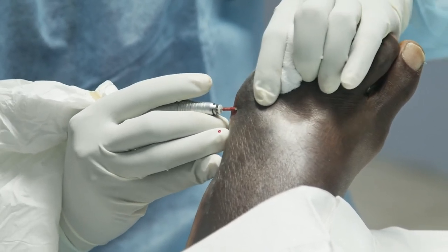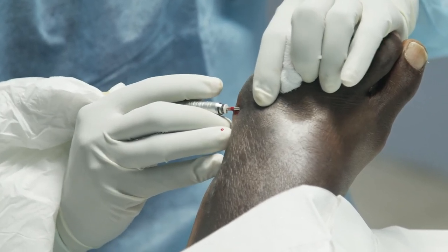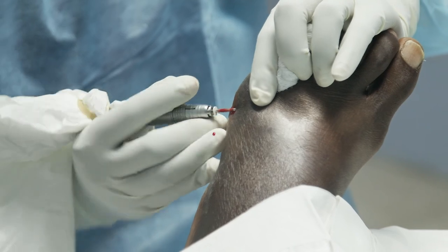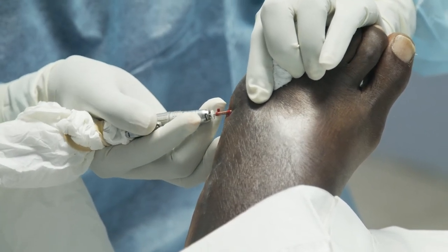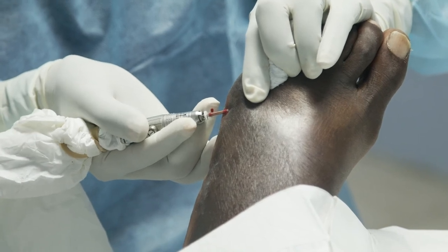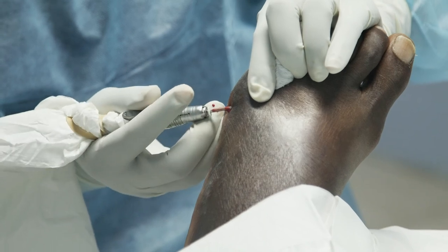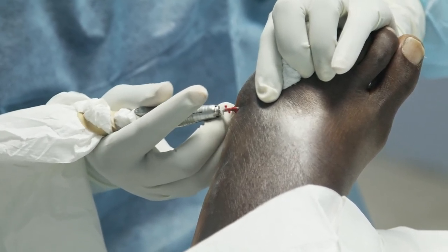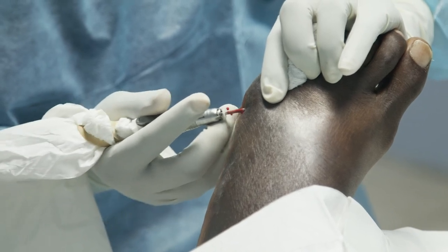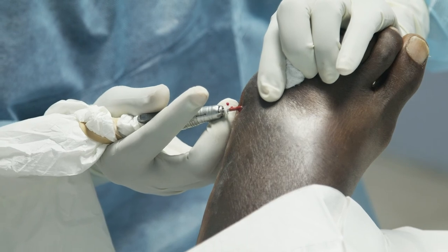So in the old days, to do this, we had to open the foot. And no one wants to open a diabetic foot, obviously. But with this precision tool now, you don't have to open it. You do it in the joint. It's like arthroscopic surgery. We've done our markers. You know exactly where you are. It's not a problem. Shaving a little bit of bone off as I'm going through, and I know exactly where we are, where we should be, and we're almost done.